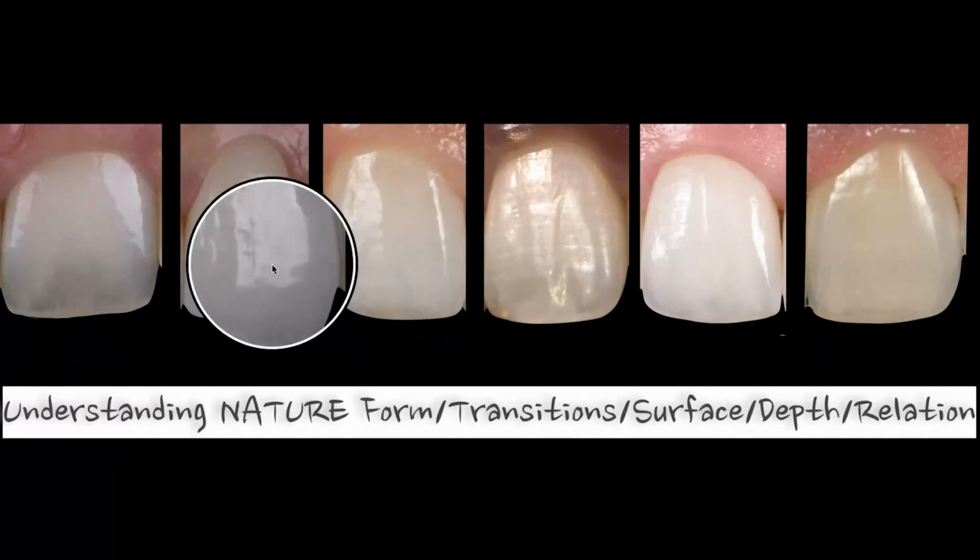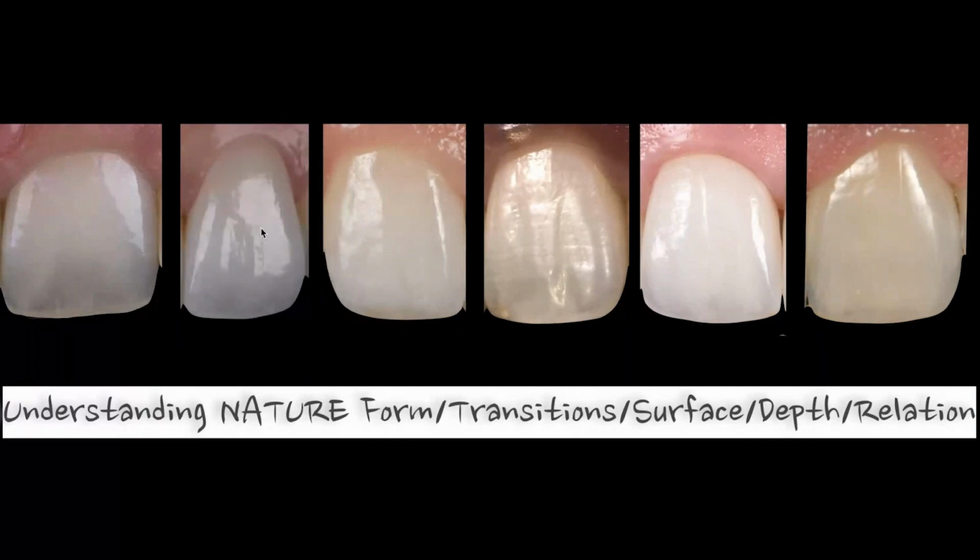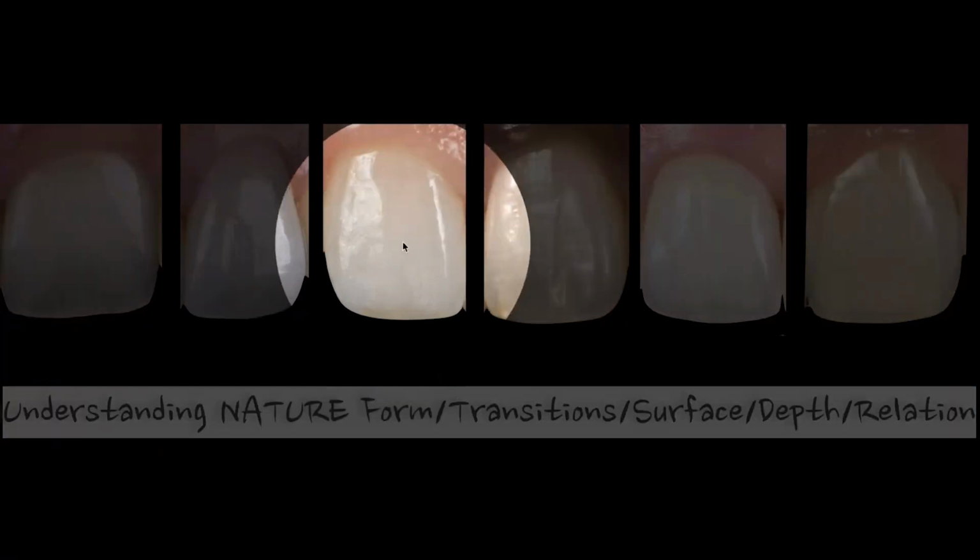And I would argue this is actually an easier tooth to make. And the reason it's easier is because there's so much happening that it makes life a little bit easier for me to match it. Where this, extremely difficult because there's such a fine amount of little surface topography that to make a single central here, I would struggle a lot more. How about the third tooth over? Let me blow this one up a little bit. Again, some surface topography, more of convexities and concavities and little details.